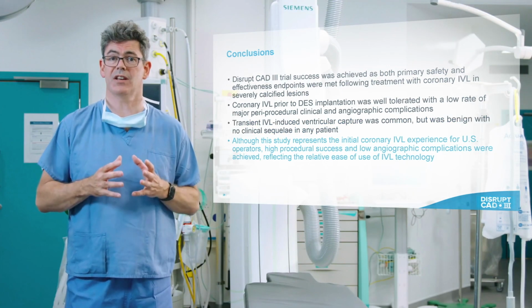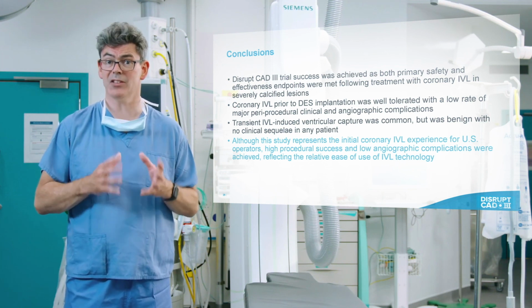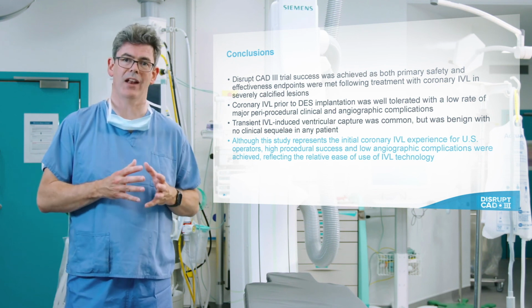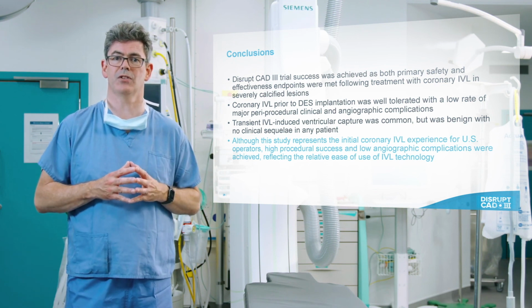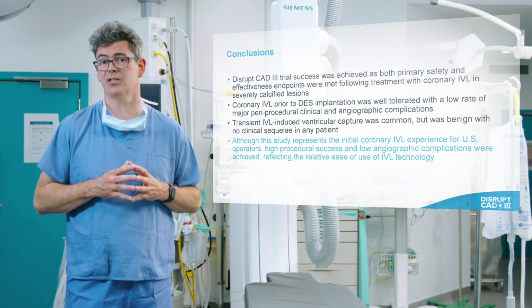And although this study represents the initial coronary IVL experience for US operators, high procedural success and low angiographic complications were achieved, reflecting the relative ease of use of IVL technology.